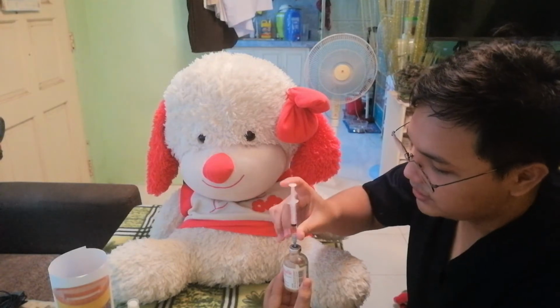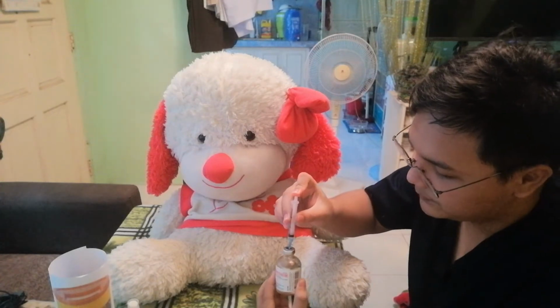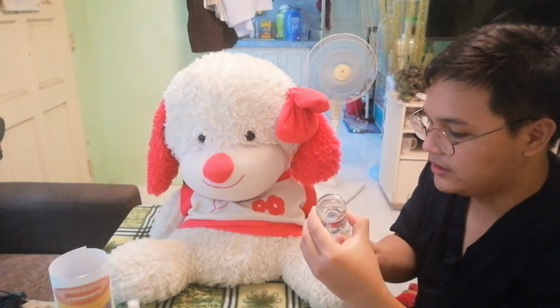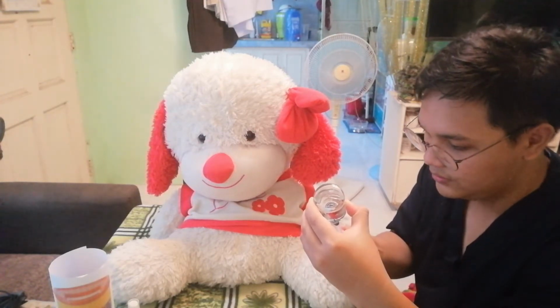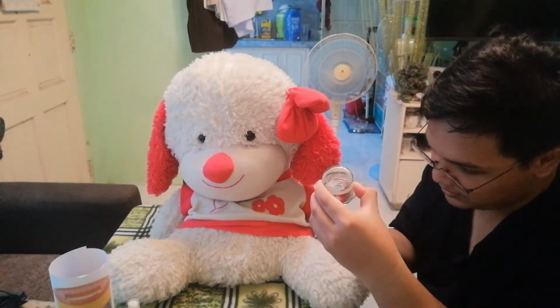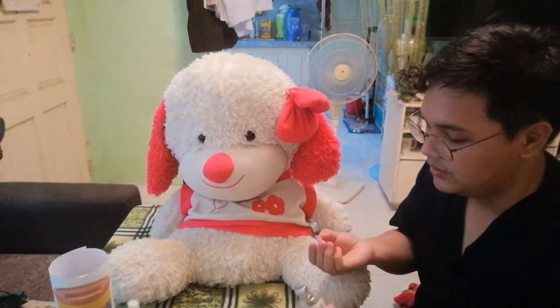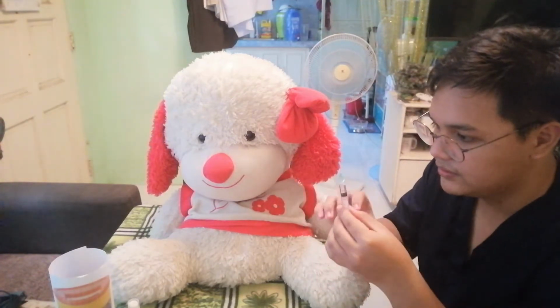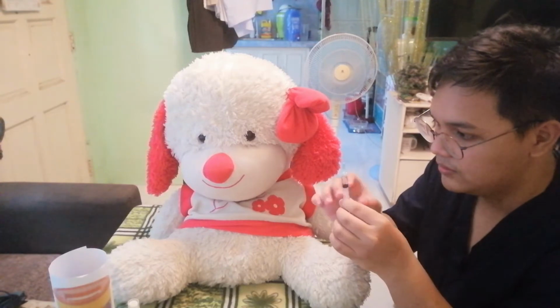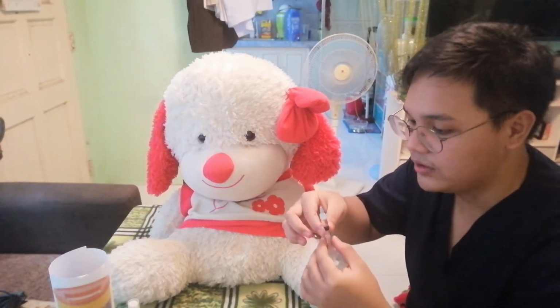Okay, after that we need to inject the air. Okay, and we need to turn our vial. Okay, and after that we will need to pull the plunger. Okay. After that, we need to flick our syringe to expel some air. Okay. Also, it is okay if there is leaking on the tip of our syringe.